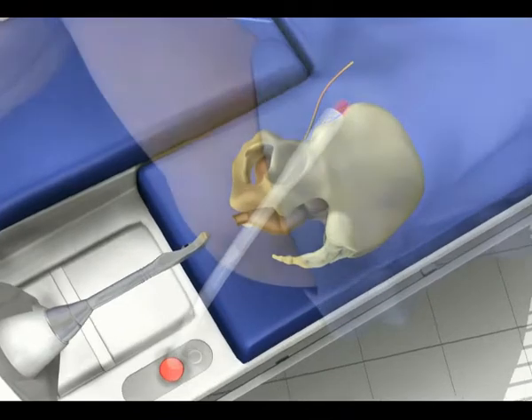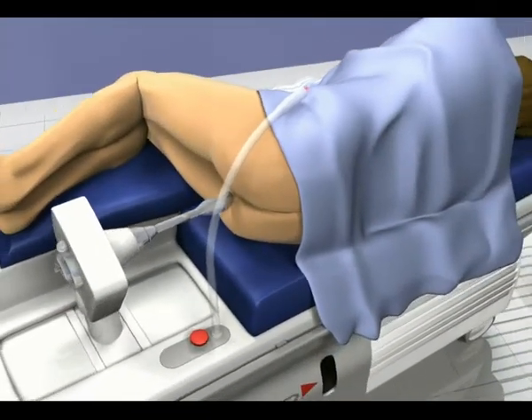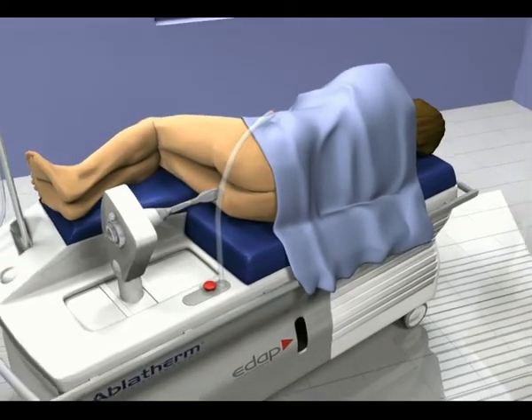The treatment then continues, lasting between one and two and a half hours depending on the volume of the targeted area.